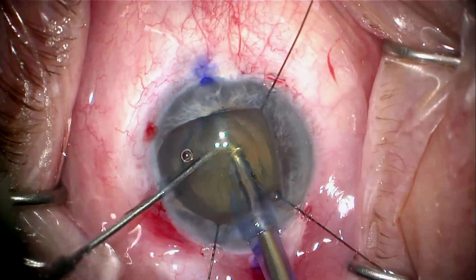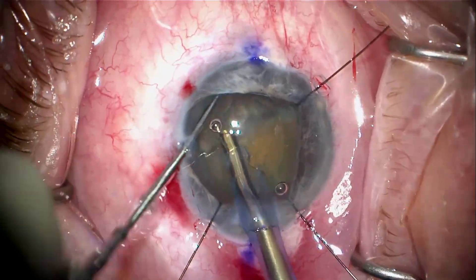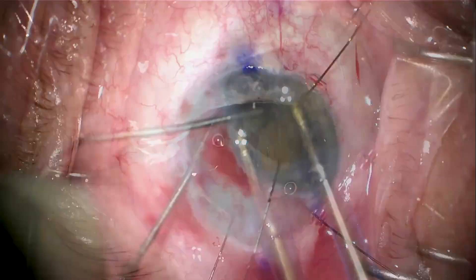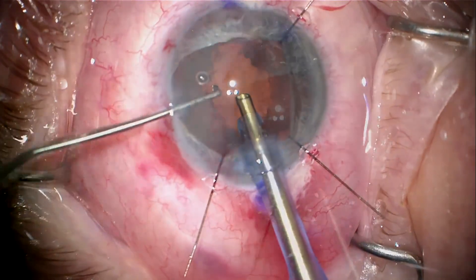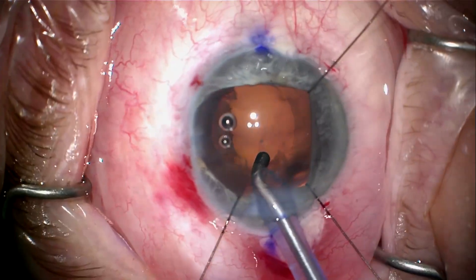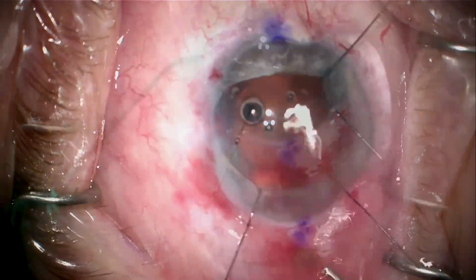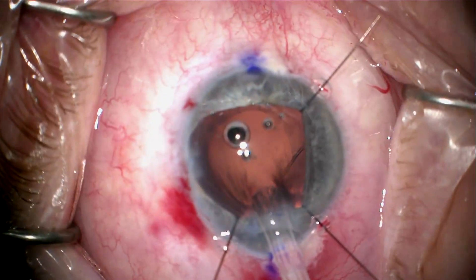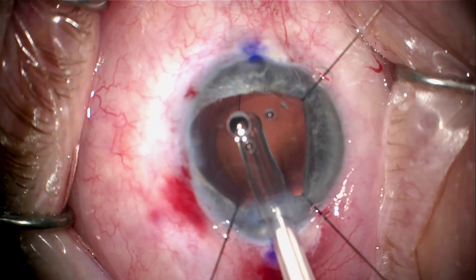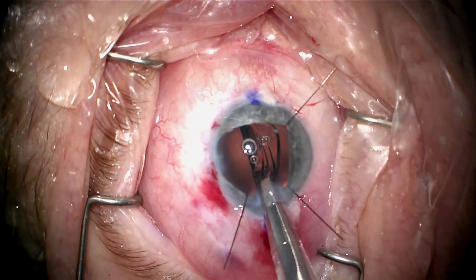We've made our capsulerhexis after staining with Vision Blue, and now we're going to go ahead and do our routine chopping technique. We try to be very gentle and preserve the endothelial cells as much as possible. I do the cortical cleanup and inject a capsule tension ring after inflating the capsular bag. The capsule tension ring should help distribute the forces of the remaining zonules.